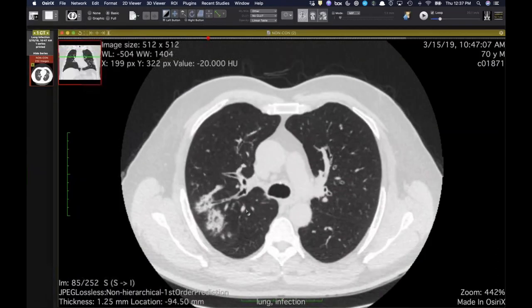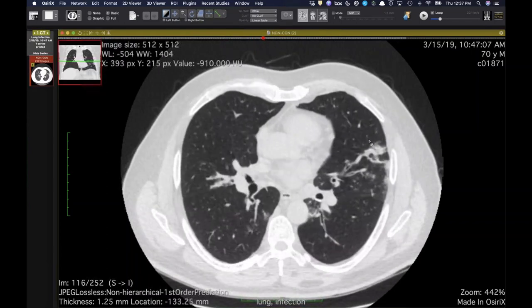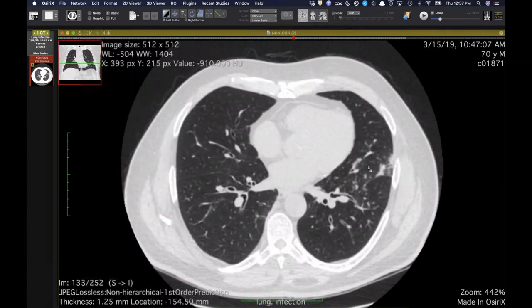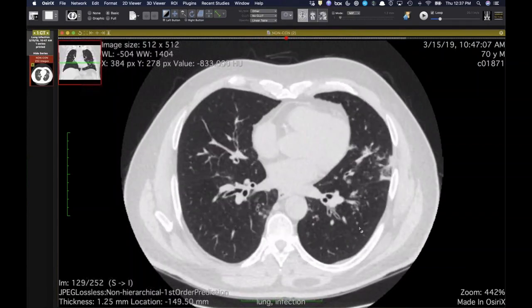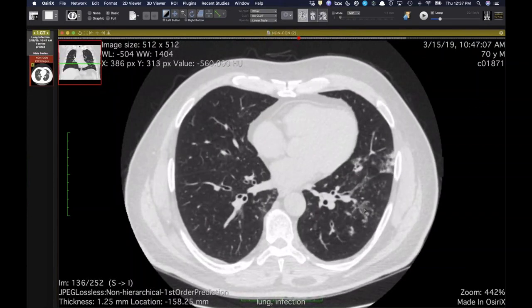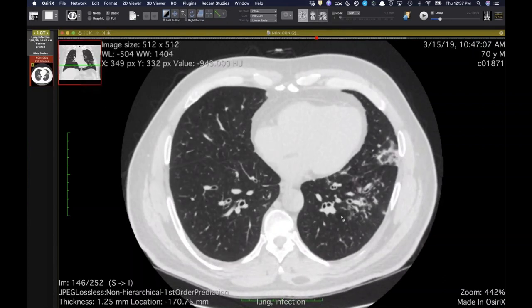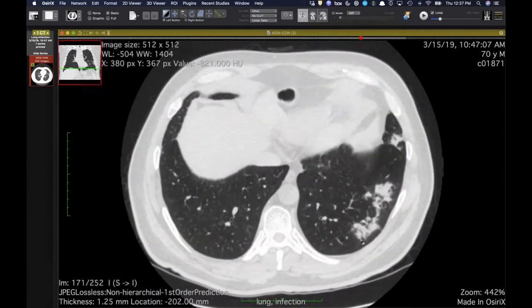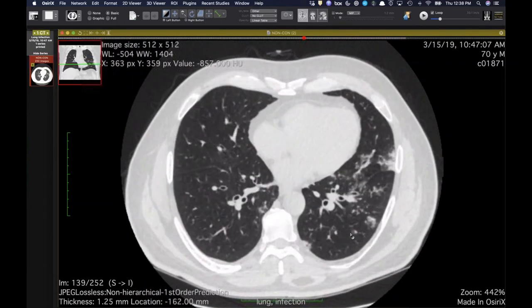And I'll show one more, just because this is one that we rarely have confirmation of a bug. This is a 70-year-old who came in with respiratory symptoms. I don't know how many negative COVID PCRs he had, but certainly many. And first and foremost, he's got tons of centrilobular and even very discrete tree-in-bud nodules, which is a very atypical or really not even reported finding of COVID.